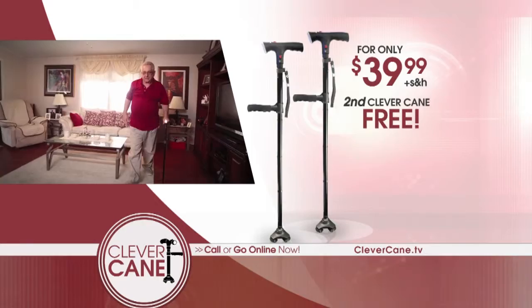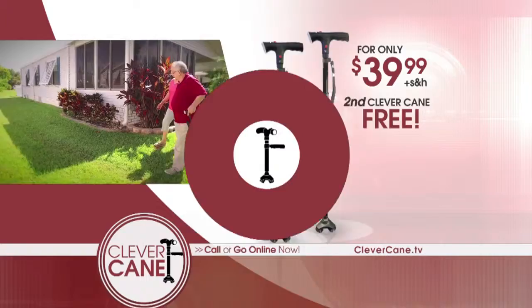If you call right now, you can get a second Clever Cane for free. That's right — two Clever Canes for the low price of only $39.99.